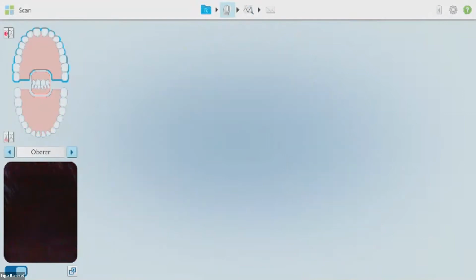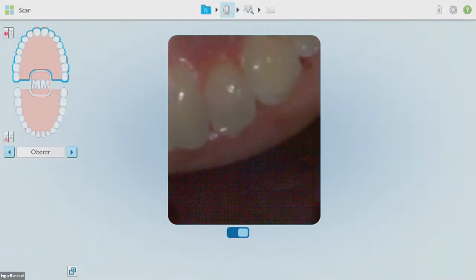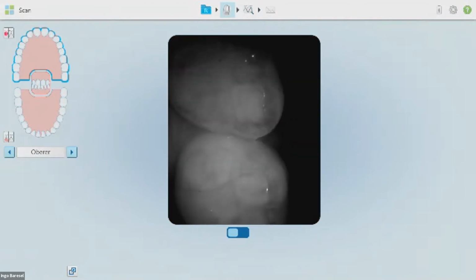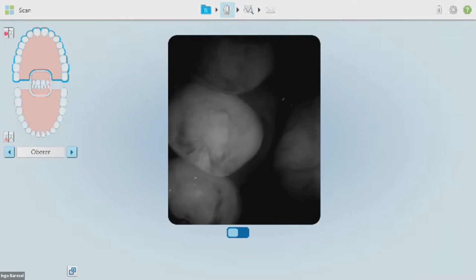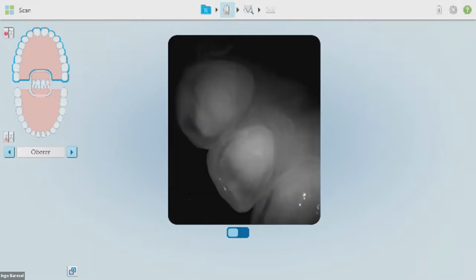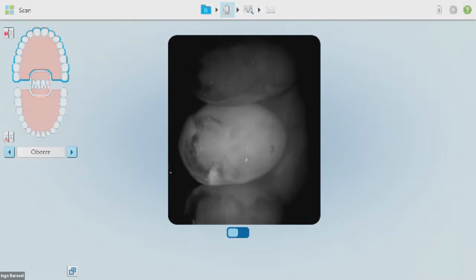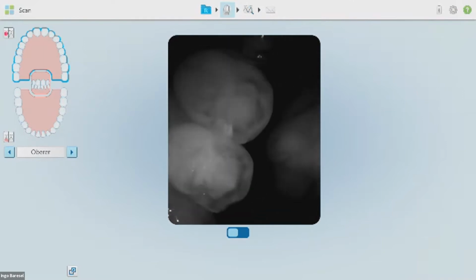And I will show you a little bit of caries detection. So we can now enlarge this picture. We can use the scanner as a camera, but we can even use it as an examination tool for caries. So look at this. And we can go through, and as you see here, you see this area here on the monitor, on the medial of the second premolar. This is some carious lesion. And we can go through and through. And you even see here, there's again some lesion. Okay? And this is what I love about caries detection. We have some x-rays from her. You don't see anything on her x-rays. But now I want to show you scanning. So you go back.